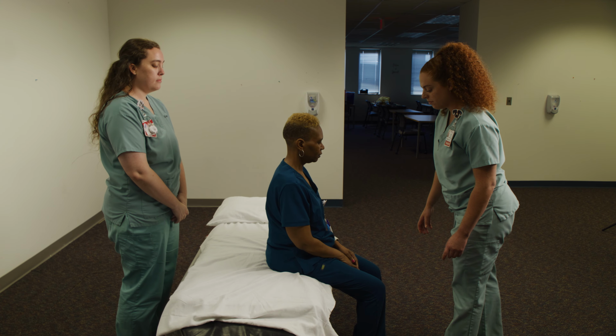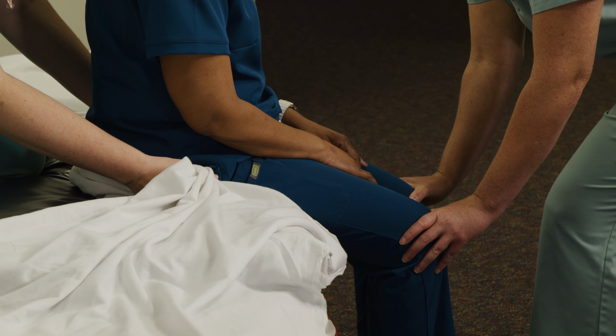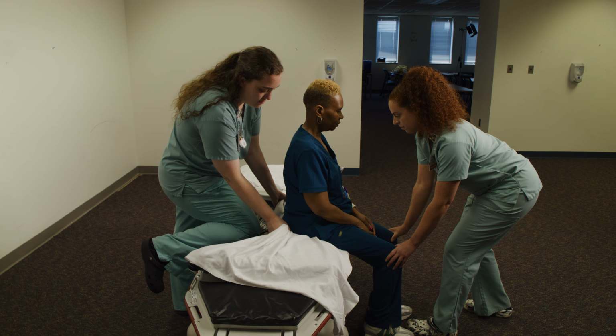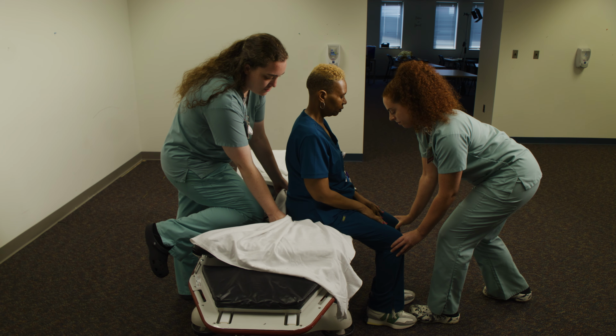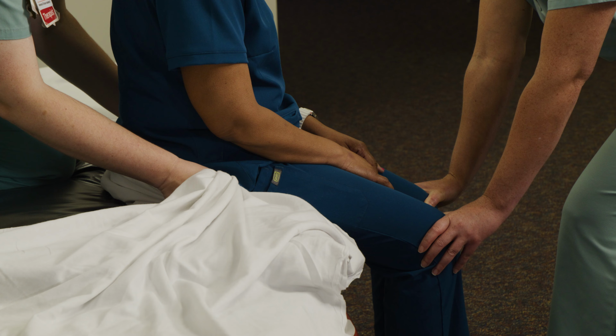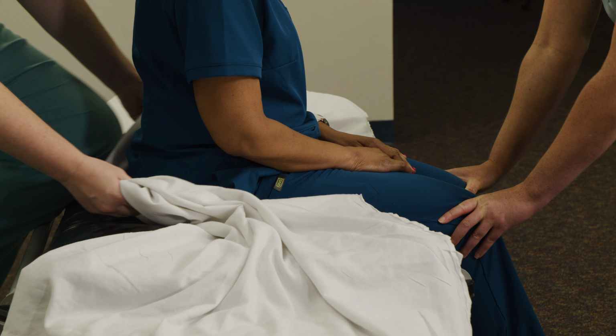If the patient slides too far forward while at the edge of the bed, there are two methods to get the patient back to a safe position. The first involves one person blocking the knees in the front and the other person behind the patient, either underneath the arms or grabbing onto the sheet. They will pull on 3 to bring the patient back safely.